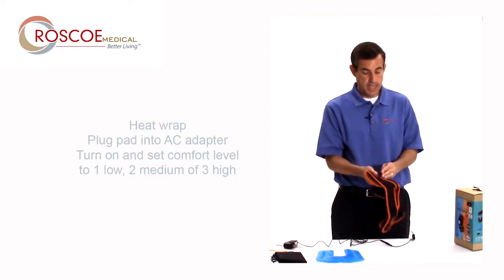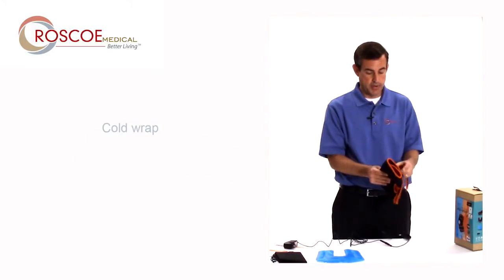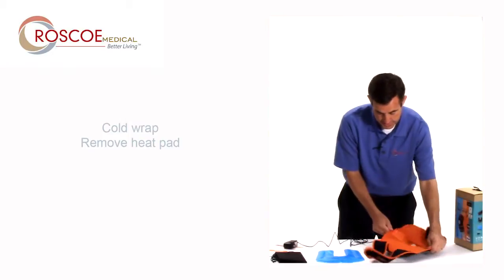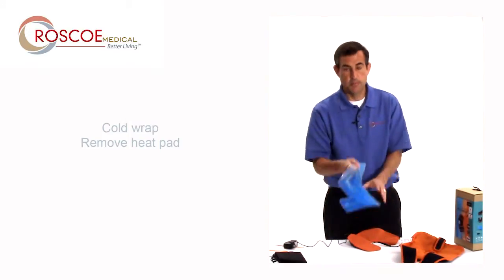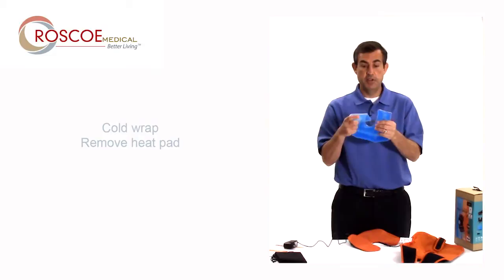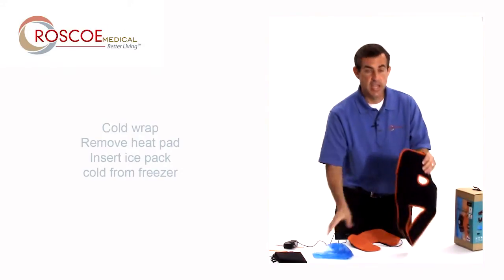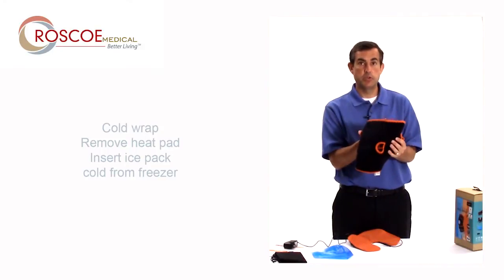If you want to use ice — let's say ice feels a little bit better — go ahead and unwrap the knee wrap, take the U-shaped heat pad out. Put in the ice pack, which has been frozen in your freezer. Put that U-shaped ice pack in the silver mesh and apply it to your knee the same way I showed you with the heat.